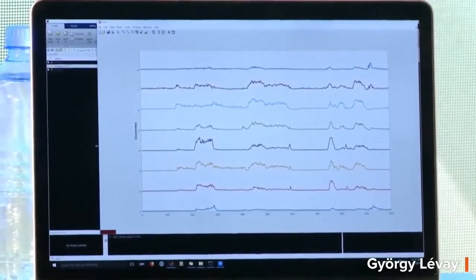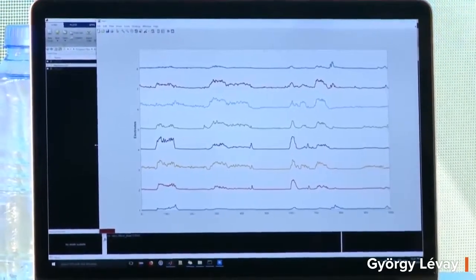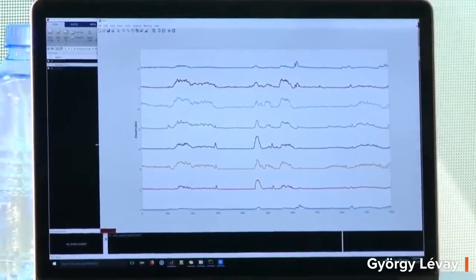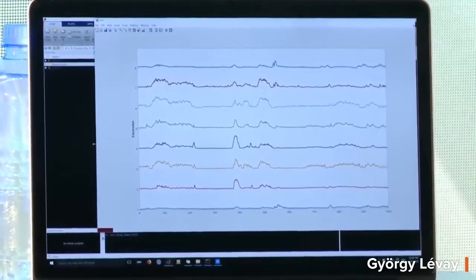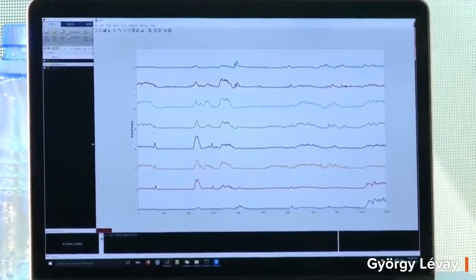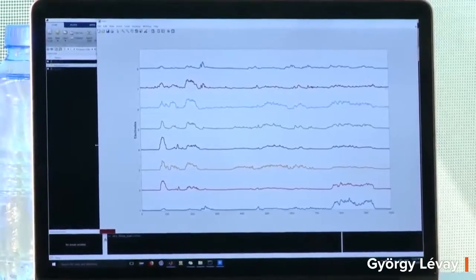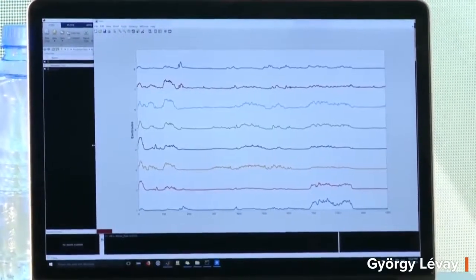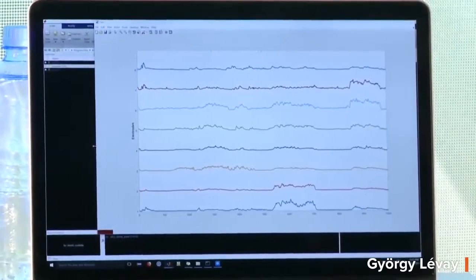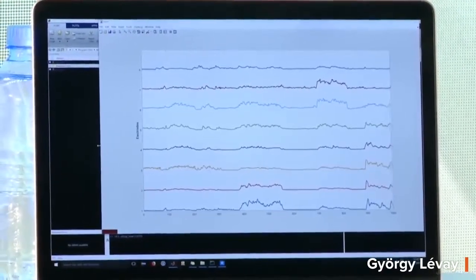And now rotate your wrist in one direction. A bit harder. Okay. You can really see the difference when I was using it hard. Yeah, and you can rest now. You can rotate in the other direction. See, again, different muscles, and you can rest now. And finally, can you extend the way you did right at the beginning? Right? And you can rest now, and you can flex, which is downwards, exactly. And you can rest now.